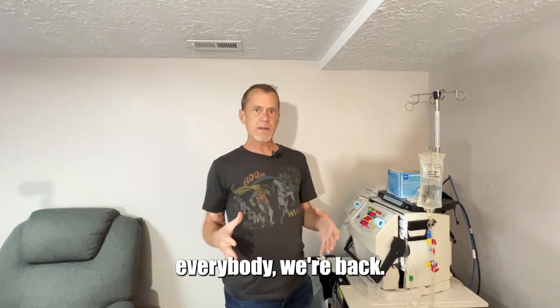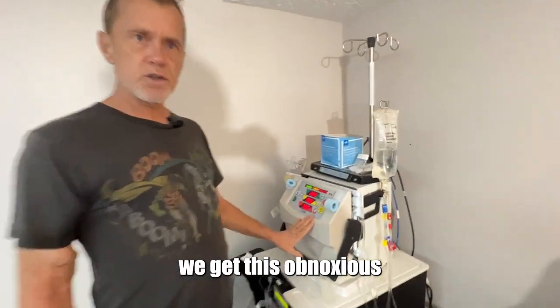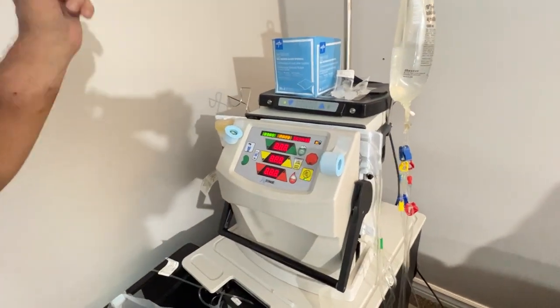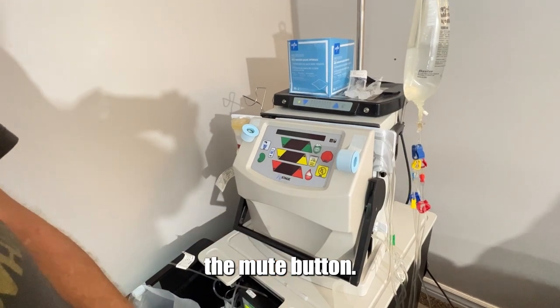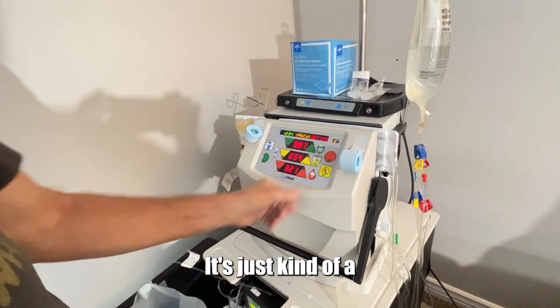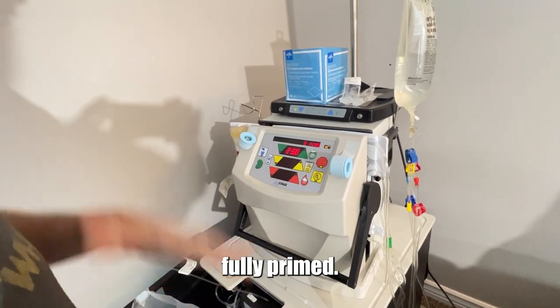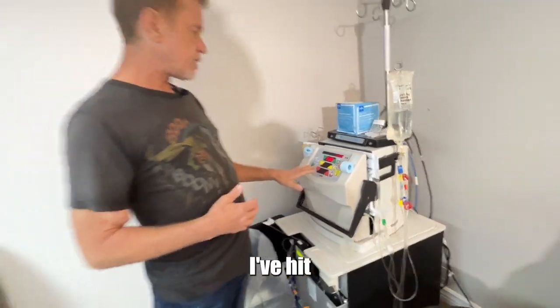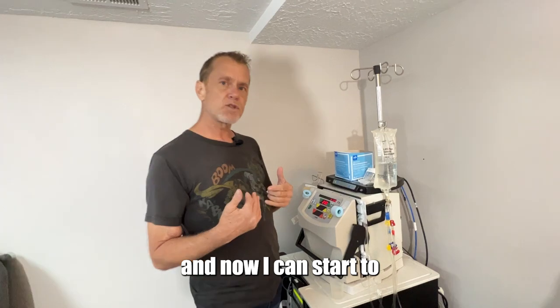All right everybody, we're back. Priming is done. To let us know, we get an alarm beeping at us. You have to clear this first by hitting the mute button. Then it brings up a second page — it's a redundancy to make sure it's cleared, fully primed, and that you've acknowledged that. Once I've hit both of those buttons, priming is done.